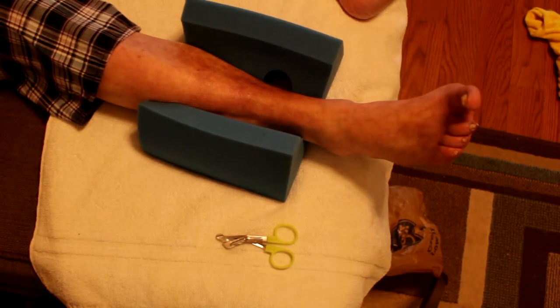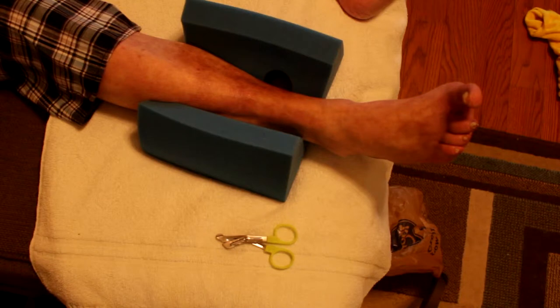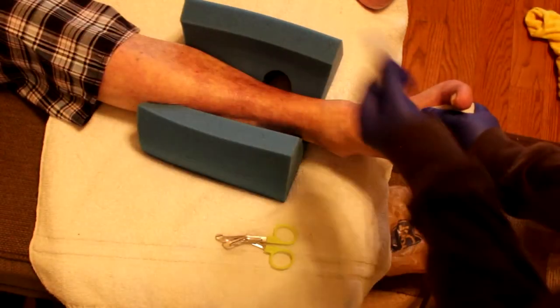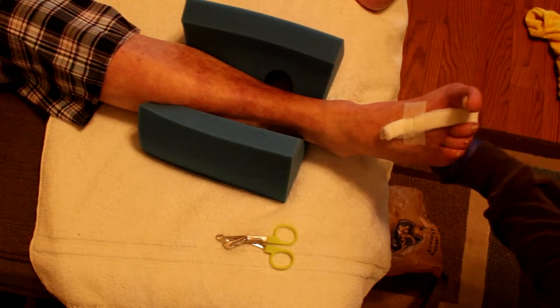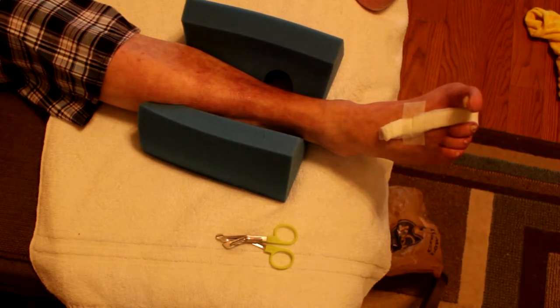I take a sterile four-by-four gauze. I'll show you what I do — I've actually taught the home health nurse who comes once a week how I do it, because my dressings stay on better than hers. What I do is fold it over in half, come around, and put it on between the toes, then put a piece of tape over it to hold it in place. Everything sticks to these gloves, which is never fun. Then I get more Santyl for the heel.